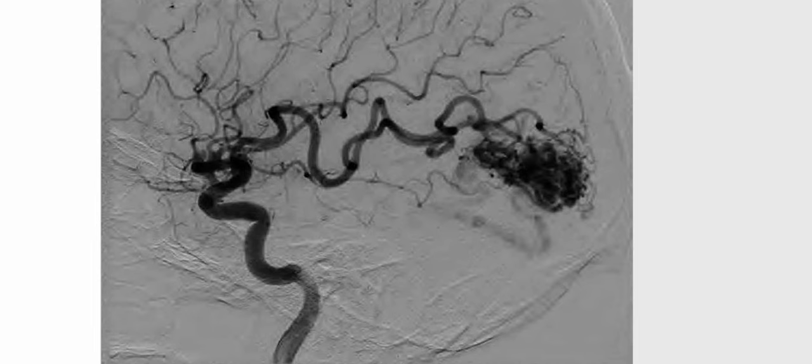So considering this key imaging finding of hypervascular cerebral mass or abnormality on DSA, obviously the top differential will be arteriovenous malformation. However, you can add hypervascular tumor or aneurysm or Moyamoya disease as well in the differential. So this is a case of arteriovenous malformation.